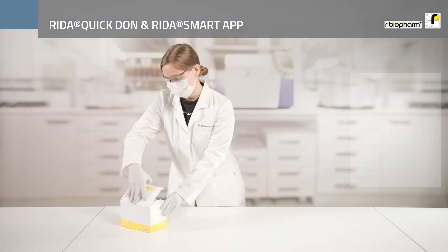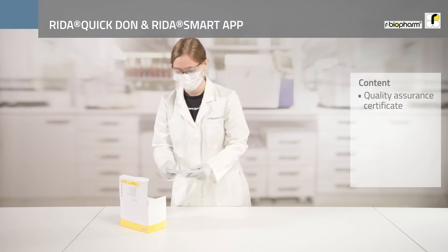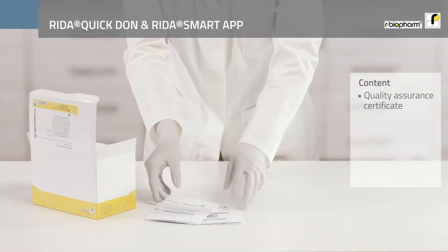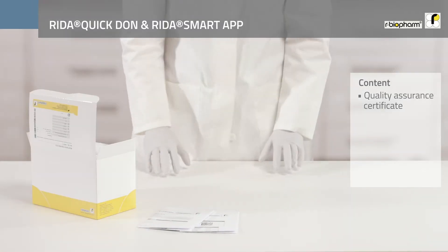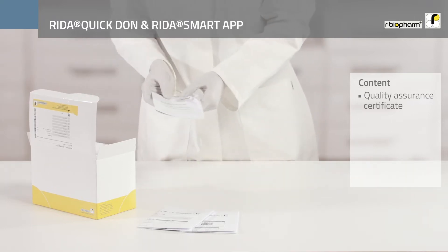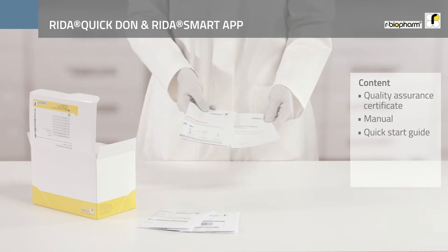The first thing you will find in the kit after opening is the Quality Assurance Certificate. On this certificate you will find all quality related information as well as the barcodes for reading the standard curves for the RIDA Smart App and the RIDA Quick Scan. Next, the kit includes detailed instructions for use and a quick start guide.